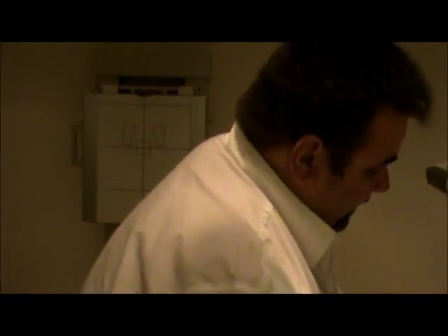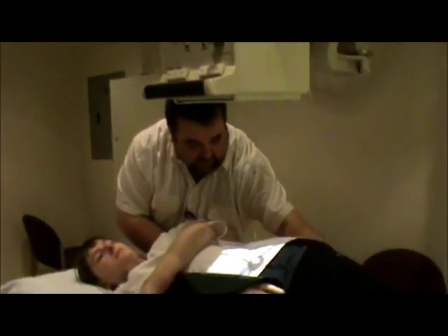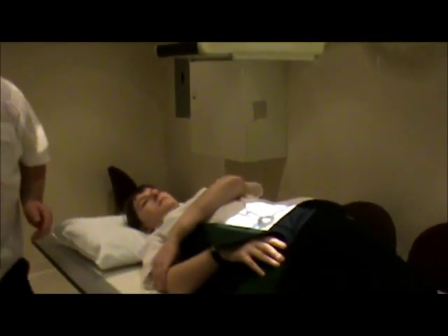Then we're going to do the other oblique. I'm going to take the sponge out. You always need to try and get your patient straight and the obliquity correct before you do your positioning. Again, we're going to palpate the upside ASIS and come in one inch medial to the upside ASIS. The collimation is going to be long and narrow. We're going to put our left marker — the patient is in an RPO position, but you're looking at the left SI joint. If you were looking at the right SI joint, the patient's in an LPO position. The techniques are 81 kV, center cell for both obliques and also for the axial projection. And this is our SI joint views.